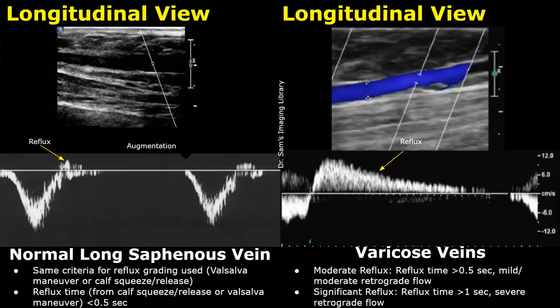On color Doppler, you will see a red color flow which will indicate reflux. The red color in this vein will be towards the probe, and the red color is seen above the baseline on spectral Doppler. Whereas the blue color indicates flow below the baseline — that is, flow away from the probe.